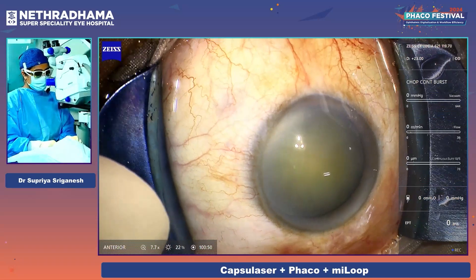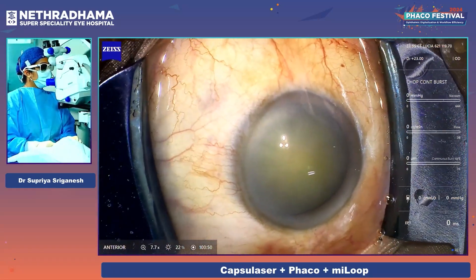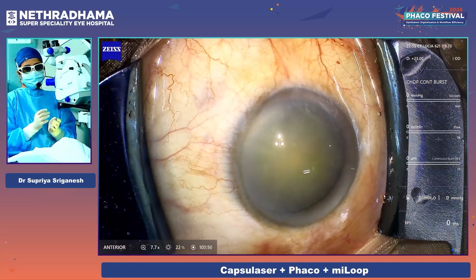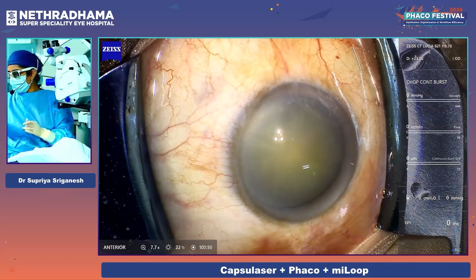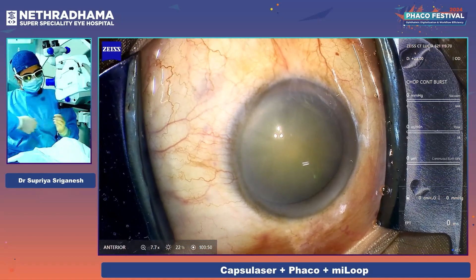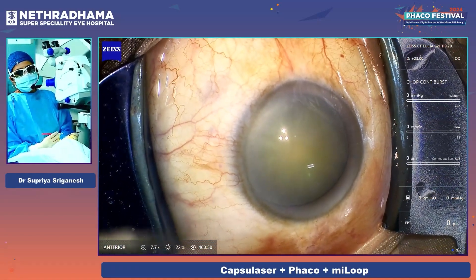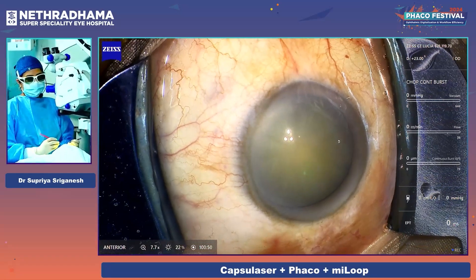The block has been given and the eye is slightly downturned. It's important that the eye is in the right position for this laser. This patient is a little uncooperative — she has a mature intumescent cataract and is not fixating well, which is why I've decided to block the case.